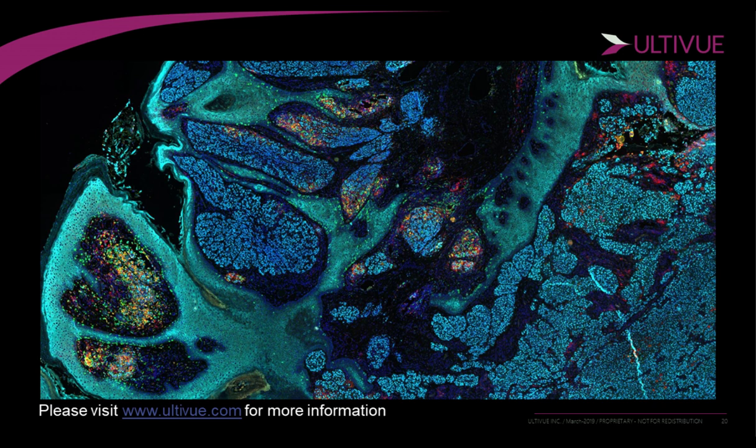We have software that can do co-registration for re-imaging the same slide and aligning those specific images. As far as the systems or image file types we can take, we're pretty flexible. Like I said before, we can work with the Axio Scan, the Vectra, and the Zeiss to do these types of stackings.